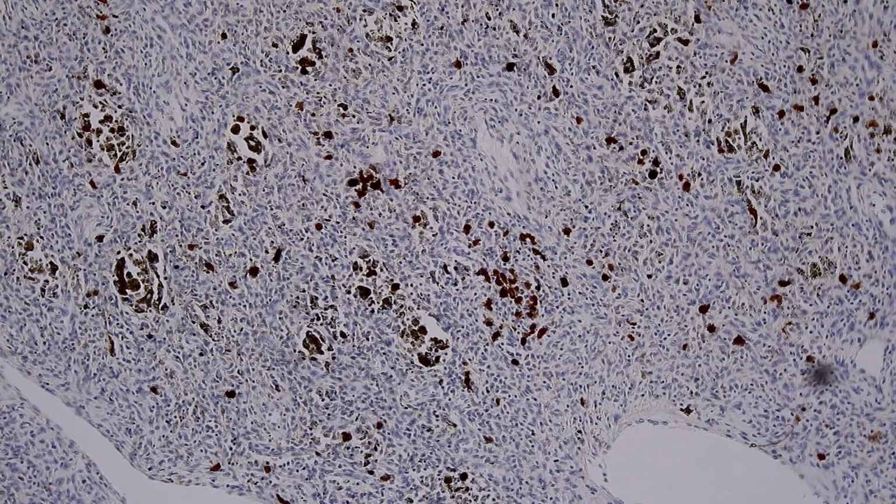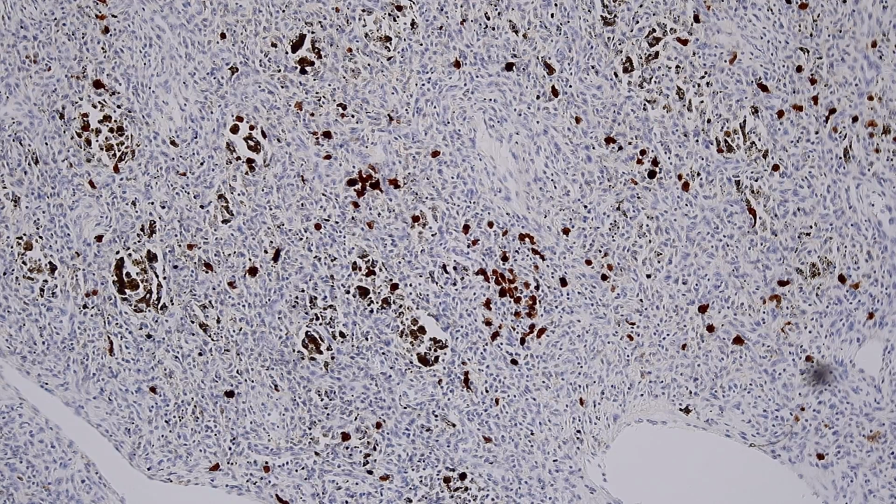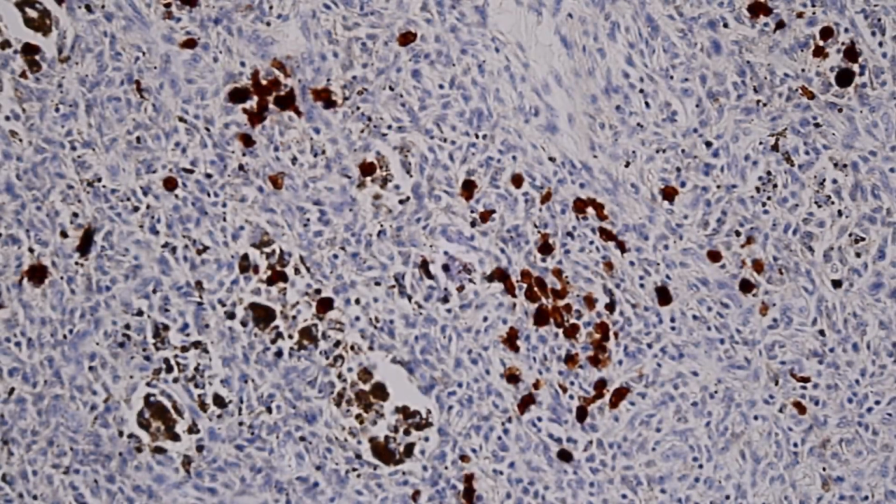And then here's one other thing. This is not the most perfect example, but I think it's good enough to show another feature that happens, and I feel like it particularly happens in these hemosiderotic or aneurysmal dermatofibromas. This is an S100 stain. Now, it's unfortunate that it's not in a red chromogen, it's brown chromogen, but I think I can still make the point, and actually we can make a second point as well.